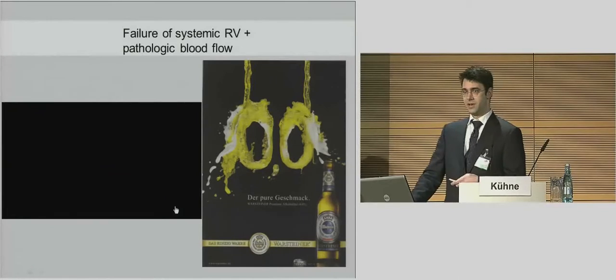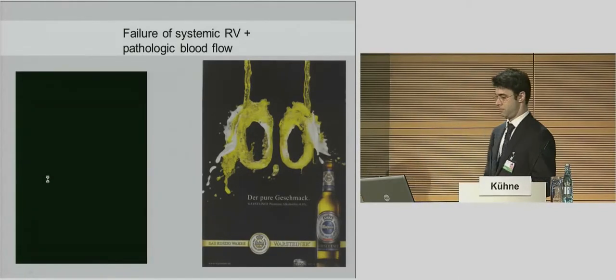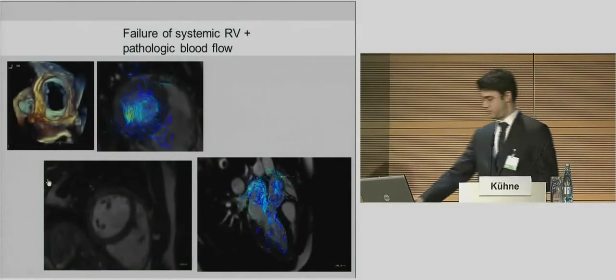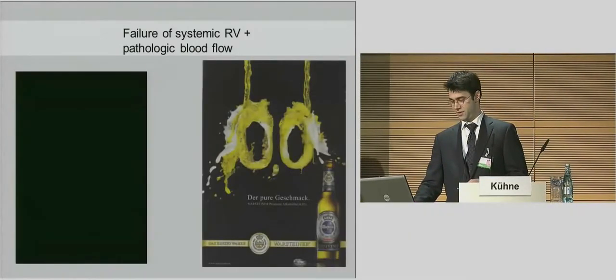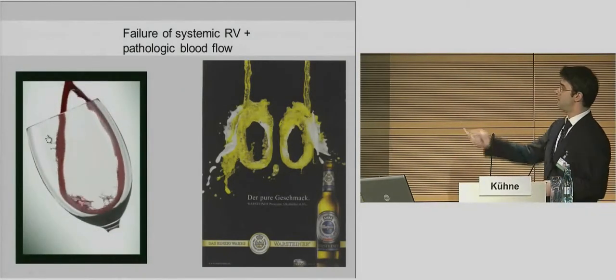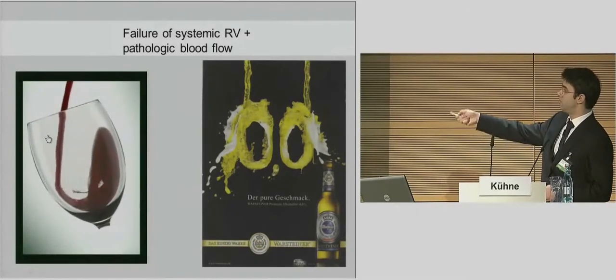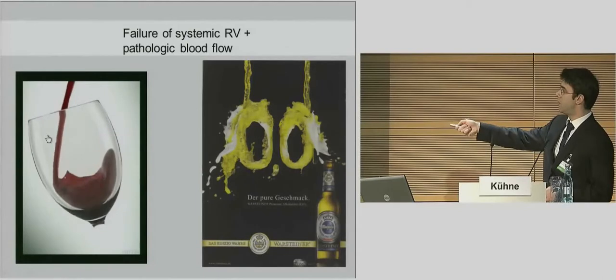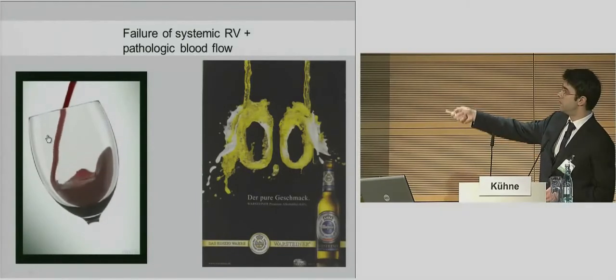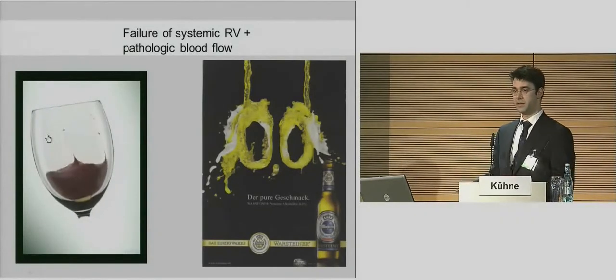Did you see what I mean? Maybe it's easier for those who are drinking wine, actually. Oh, one back. Because there one more effect is very interesting, now without sound. The blood comes in, it turns, it makes a clear movement. Now the ventricle is filled with blood. I'm still pouring something in. No movement anymore. Yeah, it just sits there.